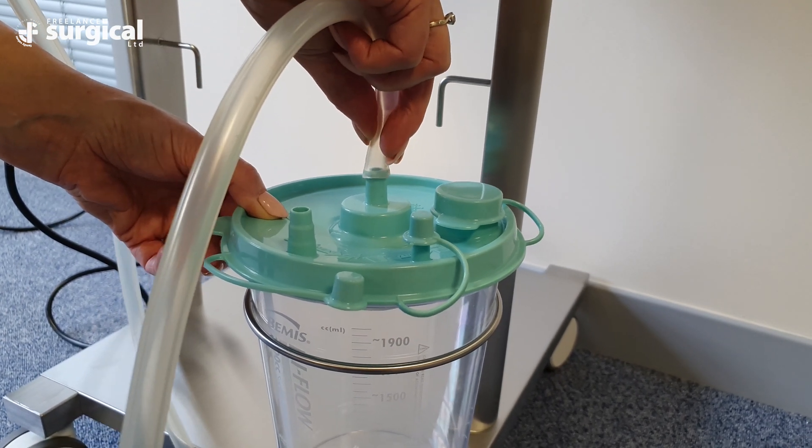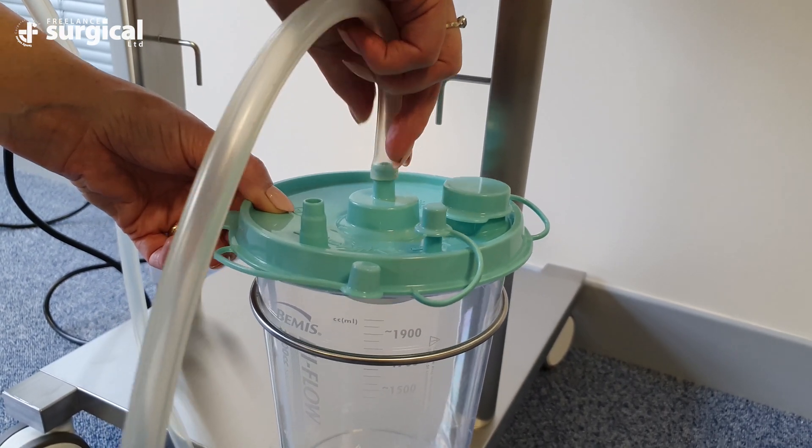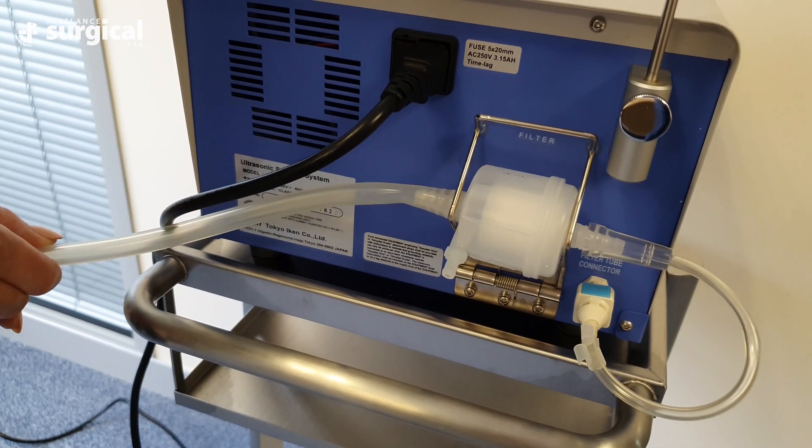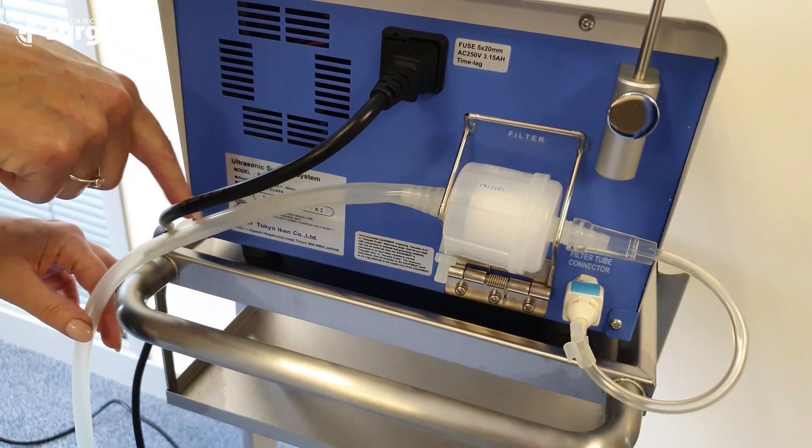It's really important that the lid of the suction bottle is secured firmly afterwards. Ensure that the filter tubing is not kinked at the filter housing itself.